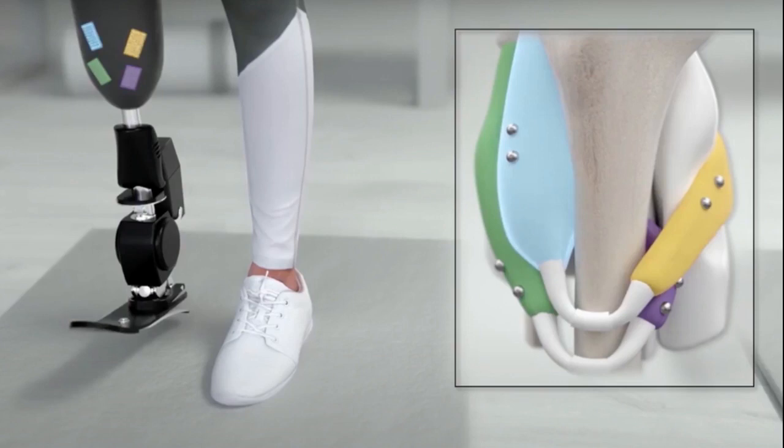The researchers envision that the beads, which consist of a magnetic core coated with gold and a polymer called parylene, could remain in tissue indefinitely once implanted. Magnets don't require an external power source, and after implanting them into the muscle, they can maintain the full strength of their magnetic field throughout the lifetime of the patient.